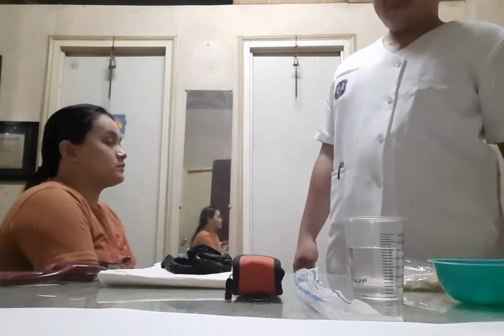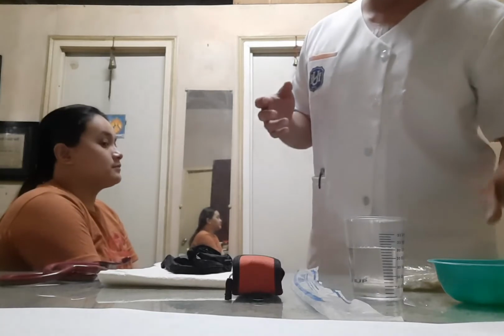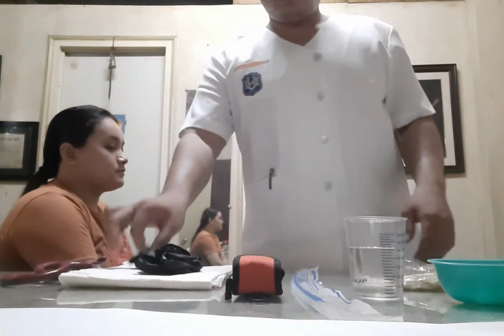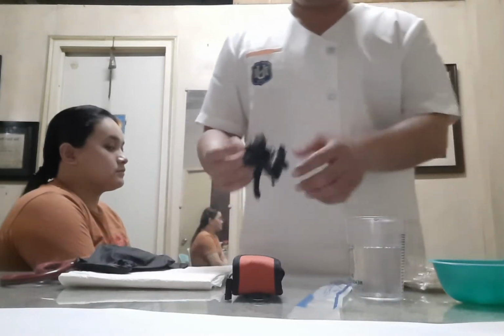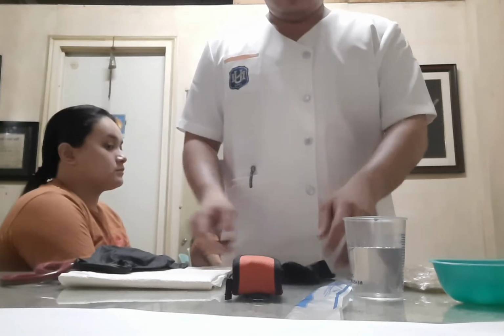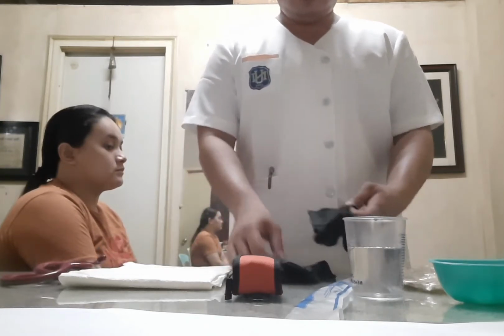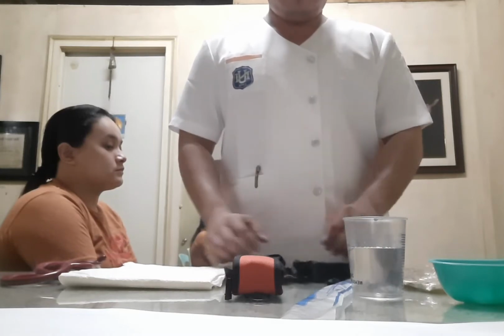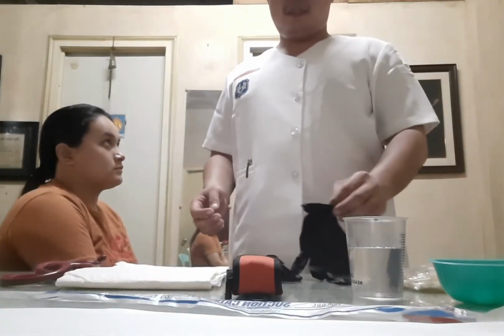And then after hand washing, I will prepare all the materials needed. Assuming that my gloves are sterile gloves, but my sterile gloves are not available, I only have the nitrile gloves.